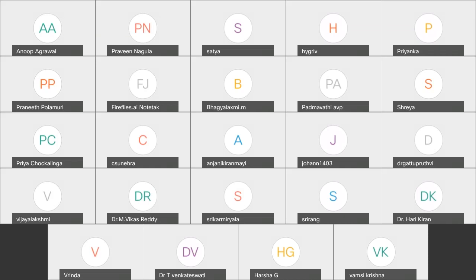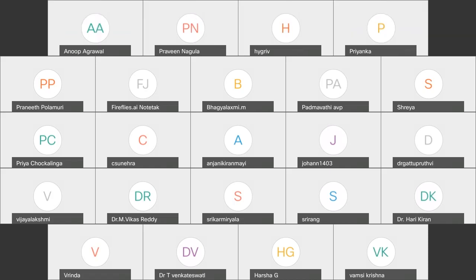And echo has a lot of false negatives, especially in this area. So MRI gives you the diagnosis, number one. Number two is the ability to look at the wall thickness, which you yourself said was a very important measure for sudden cardiac death, or one of the risk factors. It is very good because the blood pool myocardial layer differentiation is excellent in MRI. The spatial resolution is excellent. So you really get the accurate wall thickness compared to what you would get with echo.